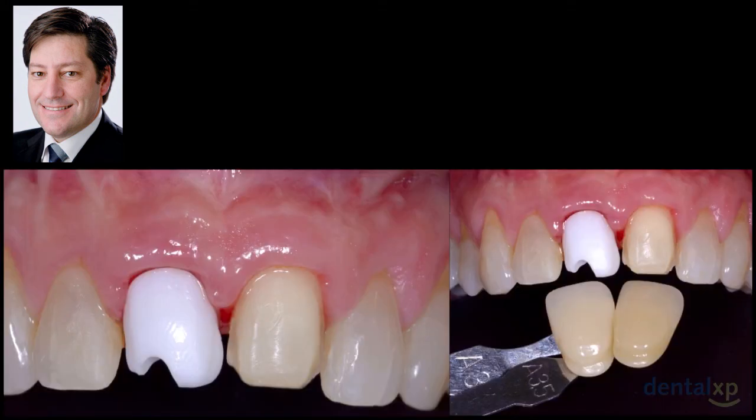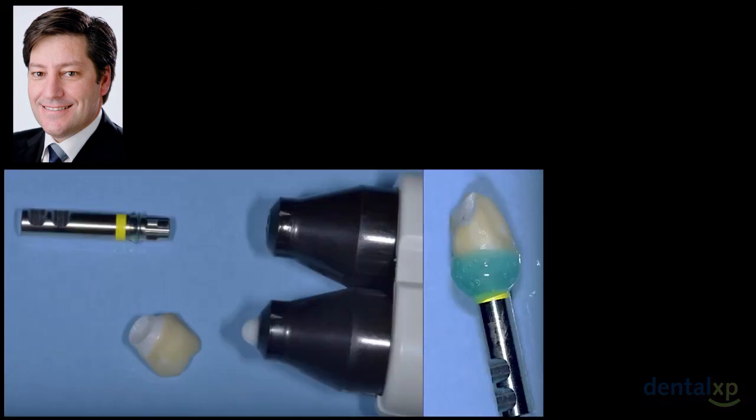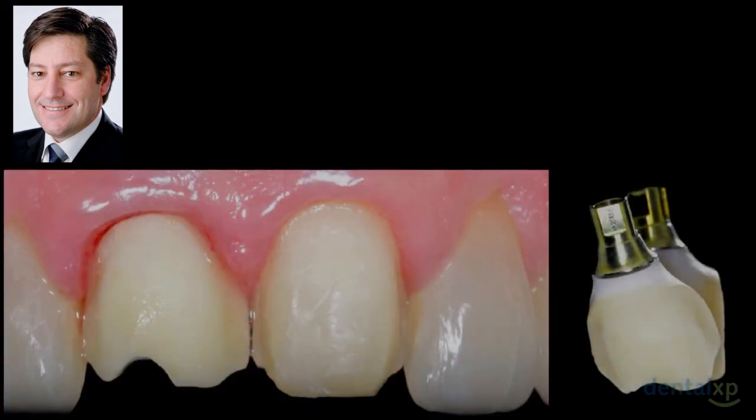You can see here, that's what I was saying. If you try to do something on this material with this color, you will be really in trouble there. So we went back, we measured the shade, we stained, and now we have a titanium-based abutment in which this veneer zirconia, this zirconia abutment with a replica of the veneer preparation on the other side, are adhesively connected to the titanium base. I put it back in, we stain it, of course. Now the two underlying structures look alike.